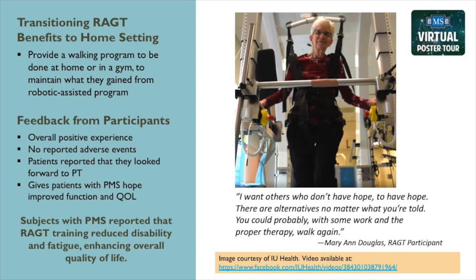What kind of comments did you receive from participants when they were working with technology? Oh boy, yeah. Well, initially some of them were very hesitant because it was a novel idea, and some of them had not ambulated more than a few steps at a time. It took some learning for them on the robots to start walking on it, but overall it was a very positive experience. And in fact, some patients actually looked forward to coming to PT compared to dreading it previously when they used to go for conventional therapy.